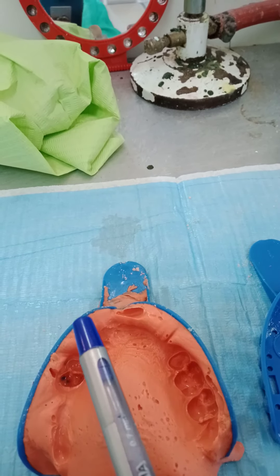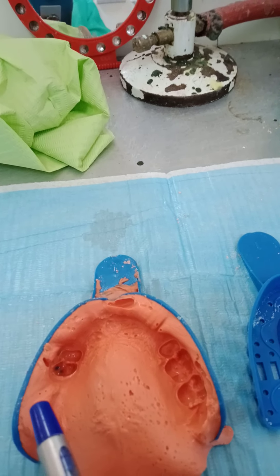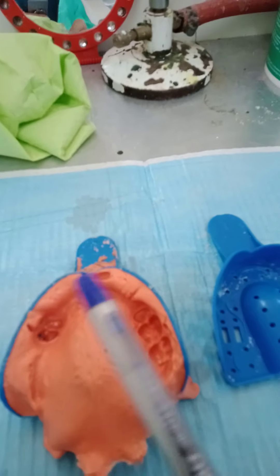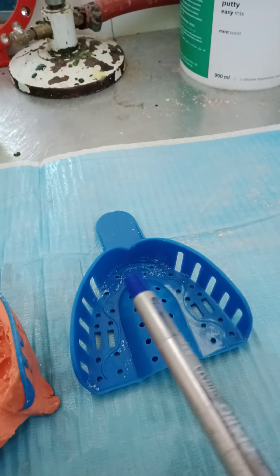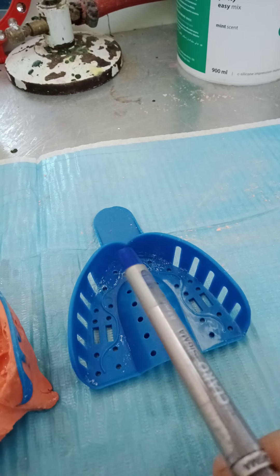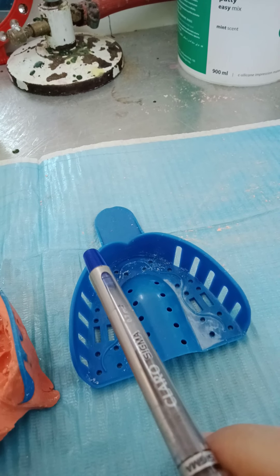I want to record the sulcus correctly and border mold around this area. So how can I do that with this tray? By using different material — I'm not going to use all alginate. I'm going to add a bit of compound here. You're going to squeeze it into place; it will do the compression. Then you border mold it around the sulcus correctly.